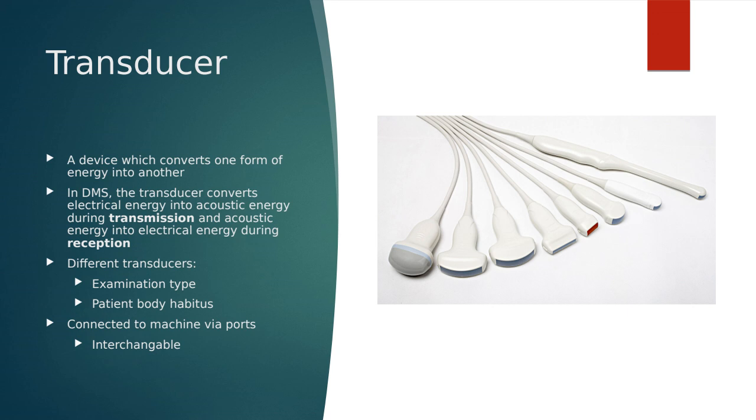So we need a piece of equipment, the transducer, to be able to convert from one type of energy to another and then back and forth again. We have different types of transducers depending on the exam we're looking at and the patient body type, so we can interchange these transducers depending on the specific scenario.